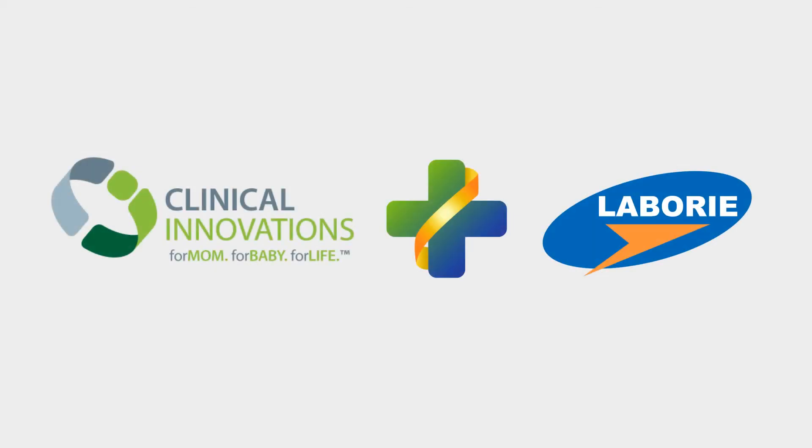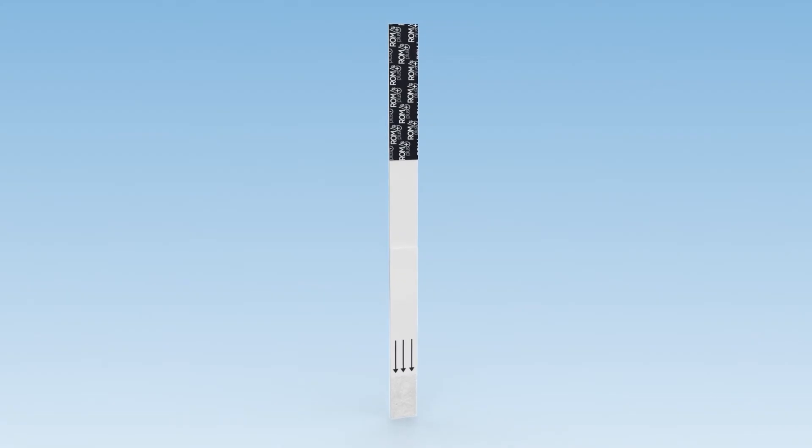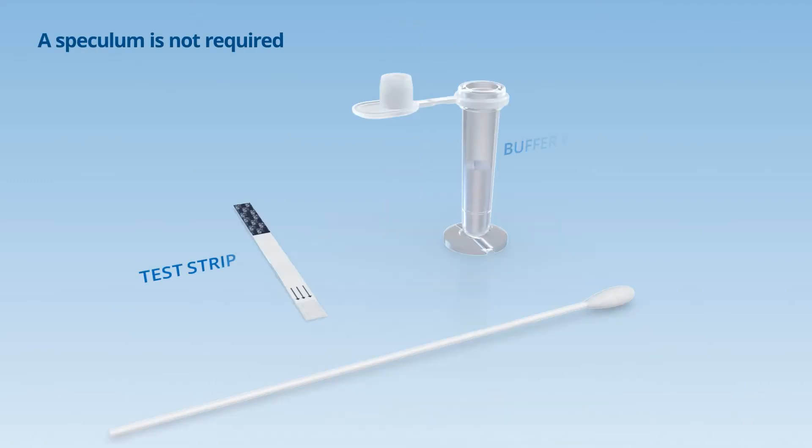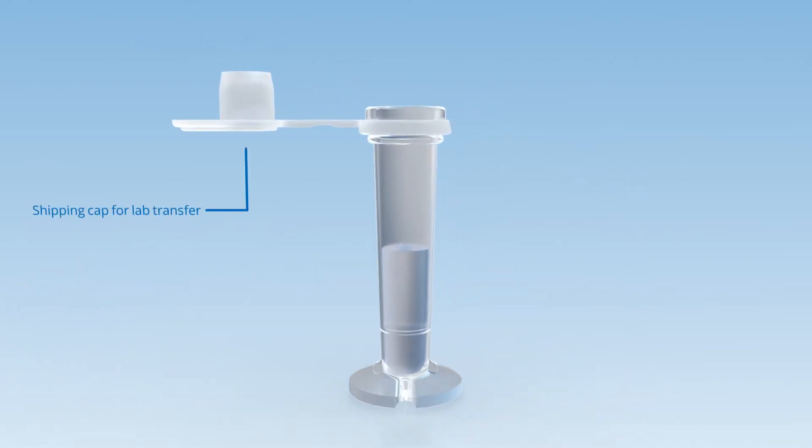Clinical Innovations is a division of Laborie Medical and is focused on the care of mothers and babies. ROM plus ES is a rapid qualitative immunoassay test used to aid in the diagnosis of rupture of fetal membranes. ROM plus ES is conveniently packaged with everything you need and can be easily run at the point of care.